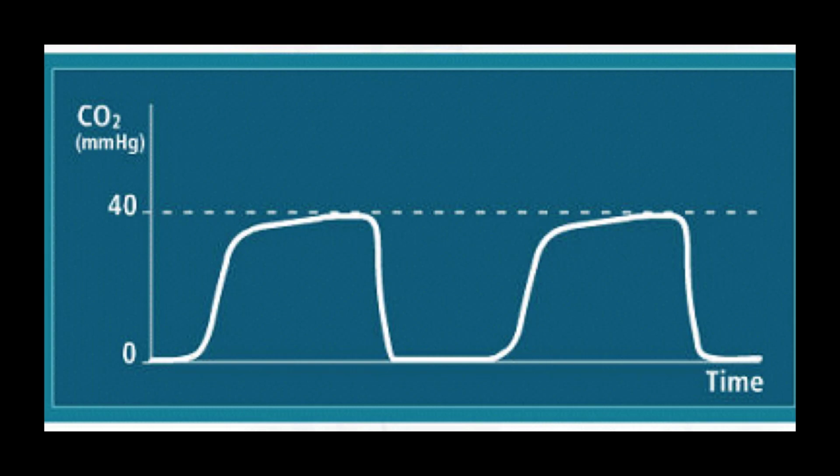In the emergency room, we do not want to see colorimetric capnography being used. We are trying to disseminate that to our respiratory therapists. However, you may need to ask them to place waveform end-tidal CO2. When you're in settings outside of the emergency room, in a pre-hospital environment or on the floor, colorimetric end-tidal CO2 may be the only thing that's at your disposal.